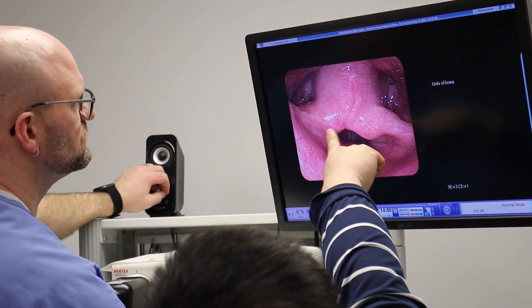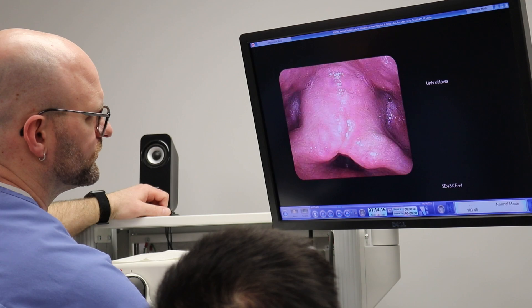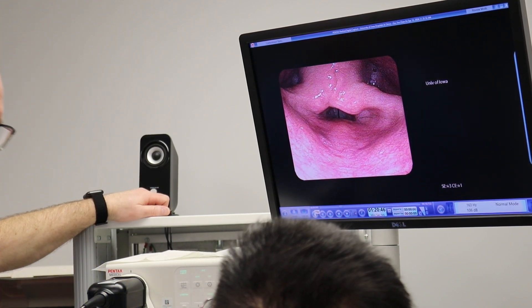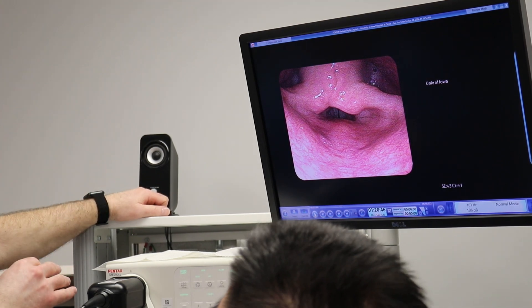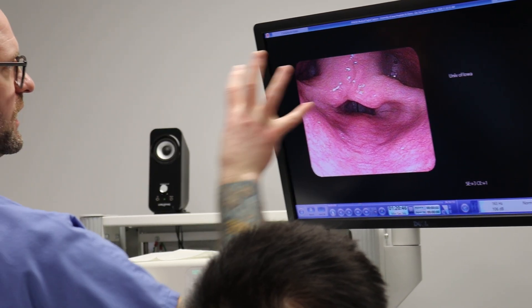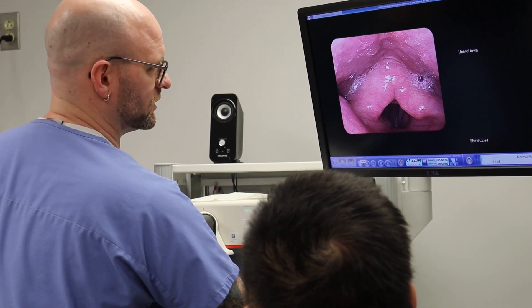So this is not swollen? No, that looks pretty good — it's supposed to look like that. It's supposed to look full. You can see the vocal folds vibrating down below there. And it's a slightly different angle from Maddie's video? Just a little bit, yeah, because we're using a different type of camera. And with the rigid scope the magnification is just a little bit more, so that's why her vocal folds were front and center on the screen. Here we're getting a little bit more of the surrounding structure just because of the different type of camera.